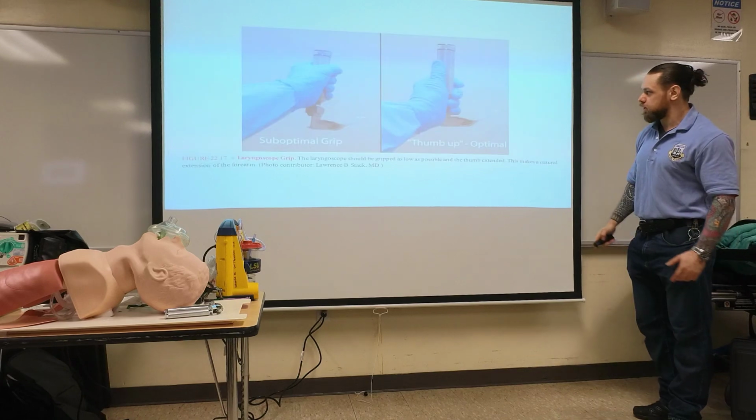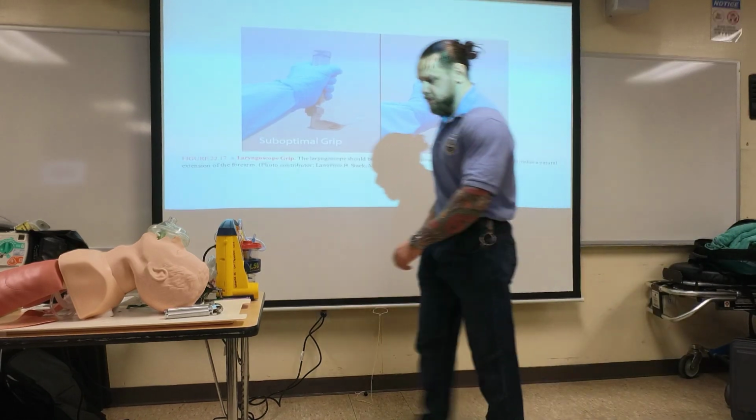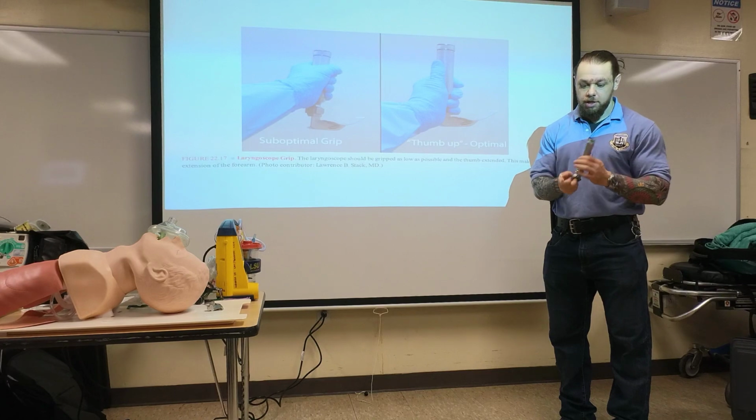We're not going to worry about this for now. I'm going to show you the best way to hold the laryngoscope. This is not a handle. This is a battery holder. This is not a handle. This is a battery holder. So how are you going to hold this?